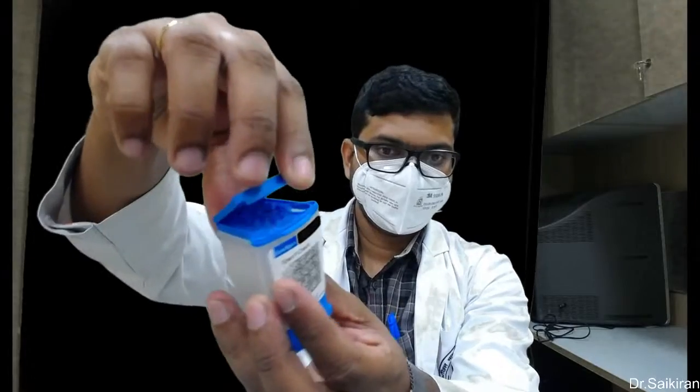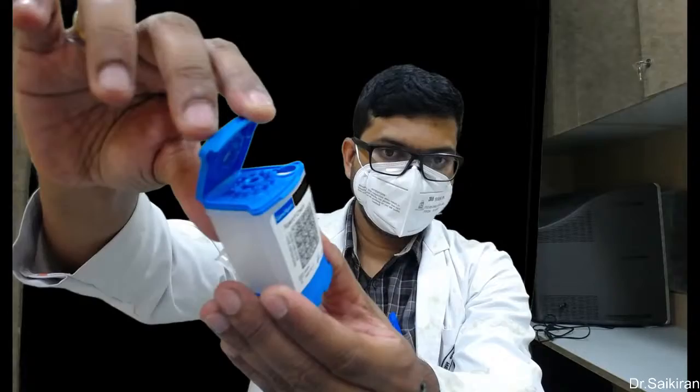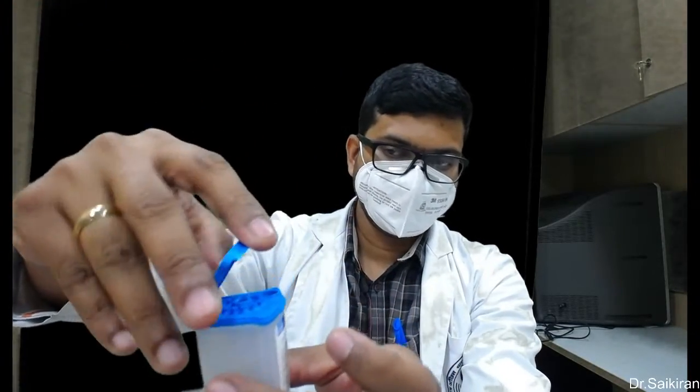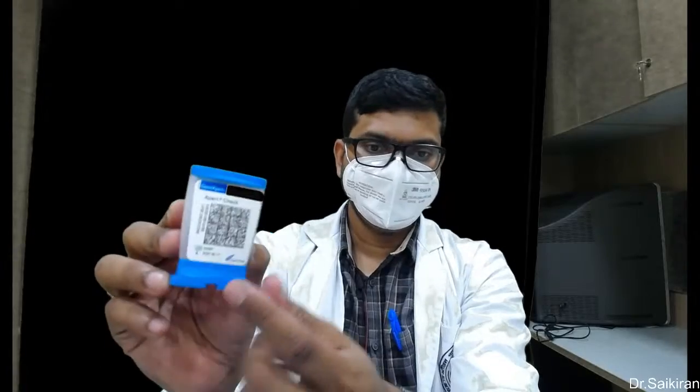where we can place a sample over here below this lid. This is the dummy cartridge, which we use only for demonstration. So in the actual cartridges, we are going to put the sample over here and close it, and we are going to scan and give the ID number, and we have to put this into the module of the GeneXpert system.